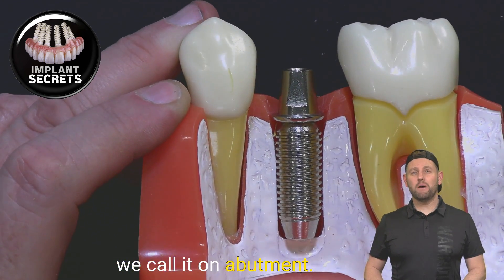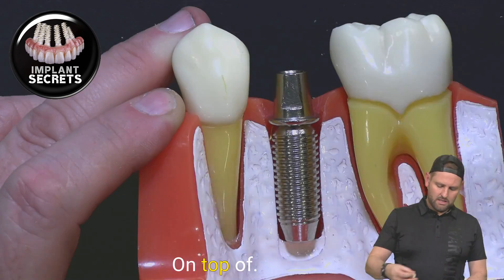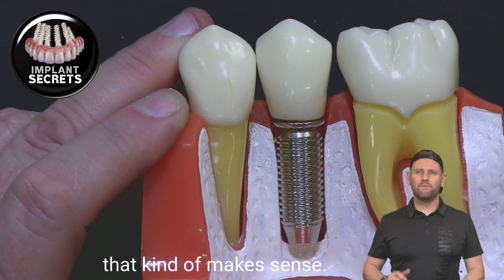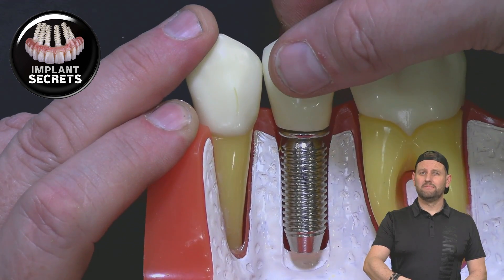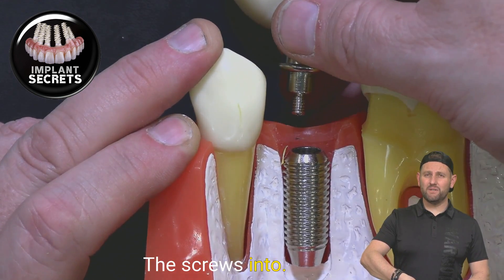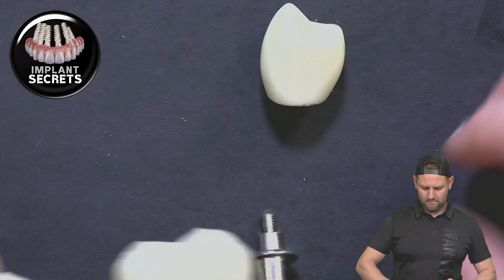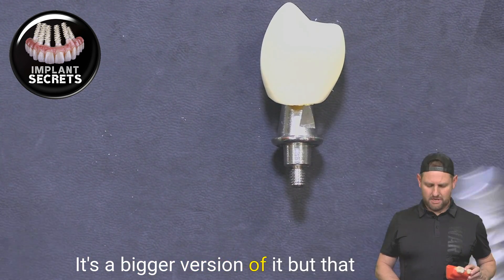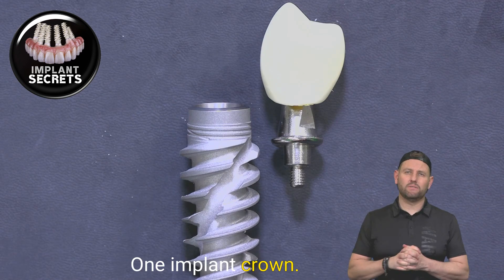This term we call an abutment — an abutment that screws into the implant. And then we build a crown on top of that. So that is a one-tooth problem solved with one tooth. Going back to the basics, there are three components: we have the actual crown called an implant crown, we have an abutment that screws into the implant, and then there is the implant itself. So it's a one-tooth, one-implant crown solution — implant, abutment, and crown.